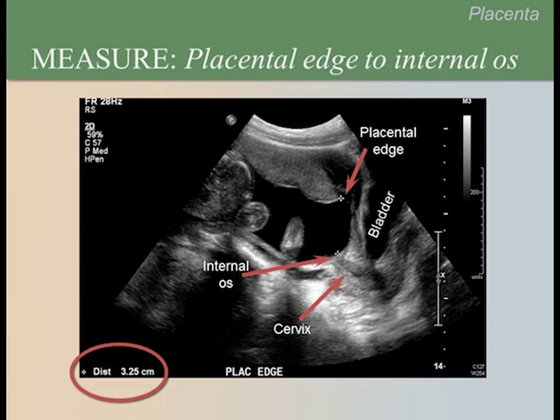Is this measurement normal? The answer is yes. A measurement greater than 2 centimeters is normal. In this case, the distance is 3.25 centimeters.